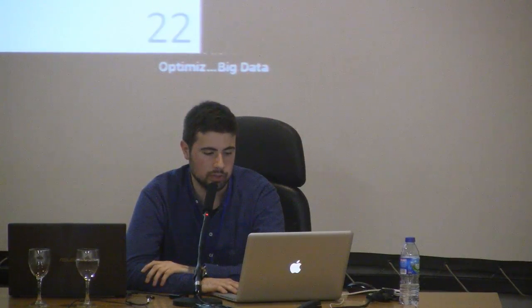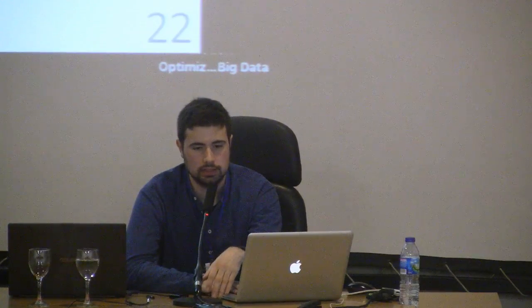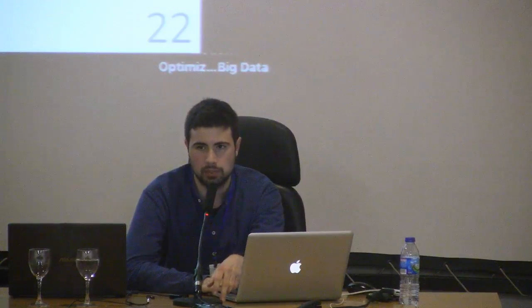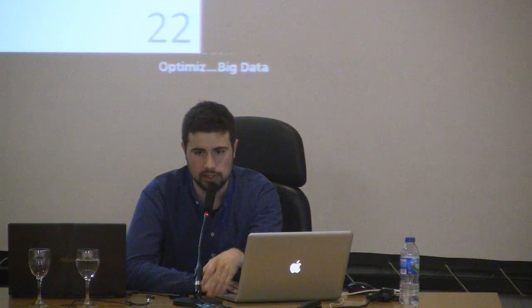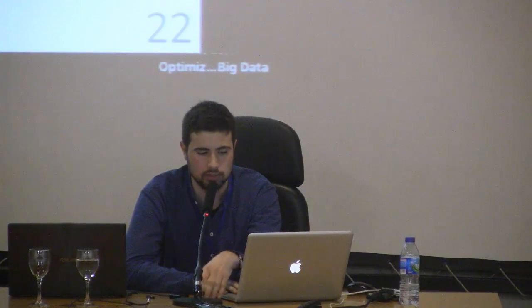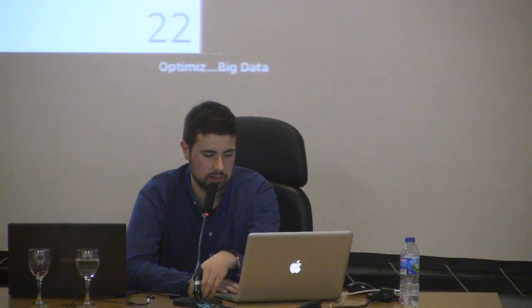That is also one of the reasons why we have the platform: to automate this processing and also to let people share the results of analyses. If a researcher has run the FreeSurfer pipeline on some data, then why does another researcher have to run the exact same pipeline again? This is not useful. If it's inside a public project, they can share those results. They can be used as a starting point, which is, in a general sense, a way to grow faster in the community.